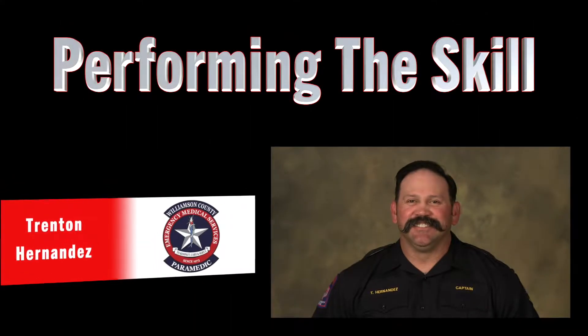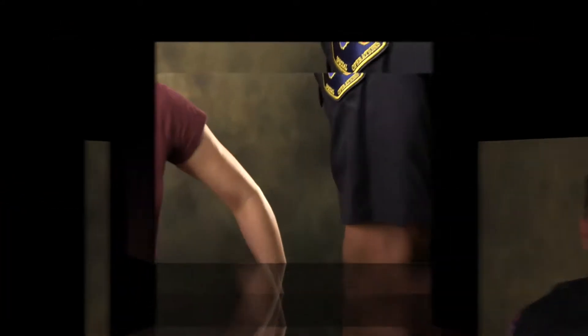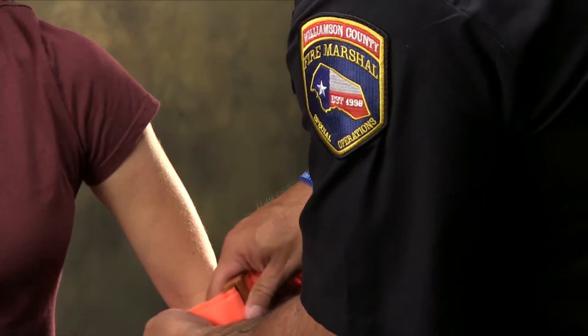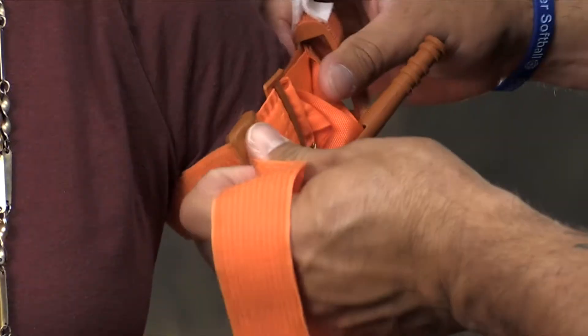I'm Trenton Hernandez, Captain with the Williamson County Fire Marshal's Office. To use on an arm, slide the looped tourniquet above the wound and place the tourniquet as high as possible.